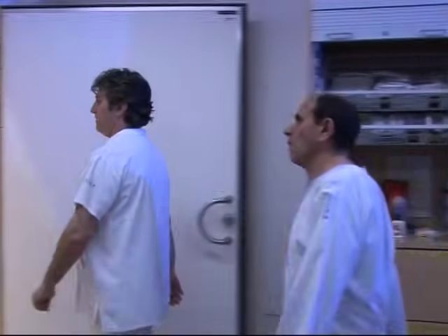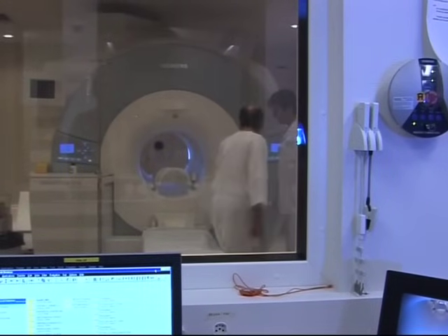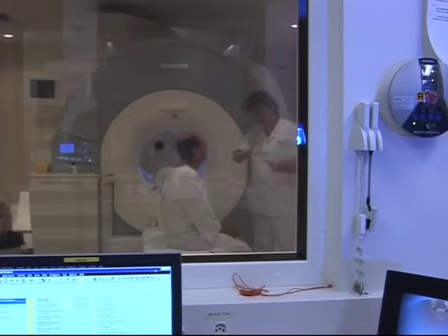We also ask women if they are pregnant, so that we can take the necessary precautions. That's it. Now we can go into the scanning room.